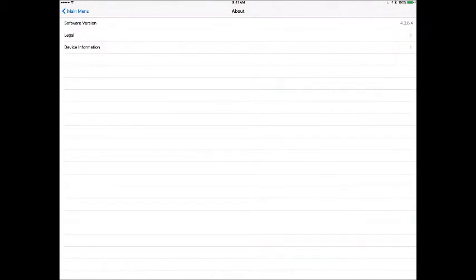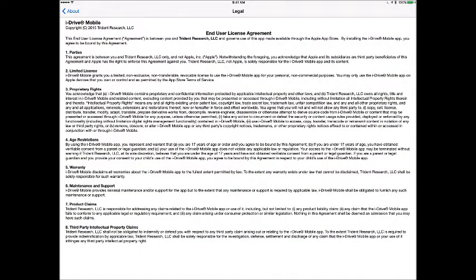But if we come back over here, of course, we've got legal documents that tell you everything with iDrive, and it's important to read these things and to understand what you're getting involved with in the programming. So, programming too, we only issue passwords to qualified and trained technicians, and if you're an ACP or a technician for a dealership, this is who we're issuing these to.